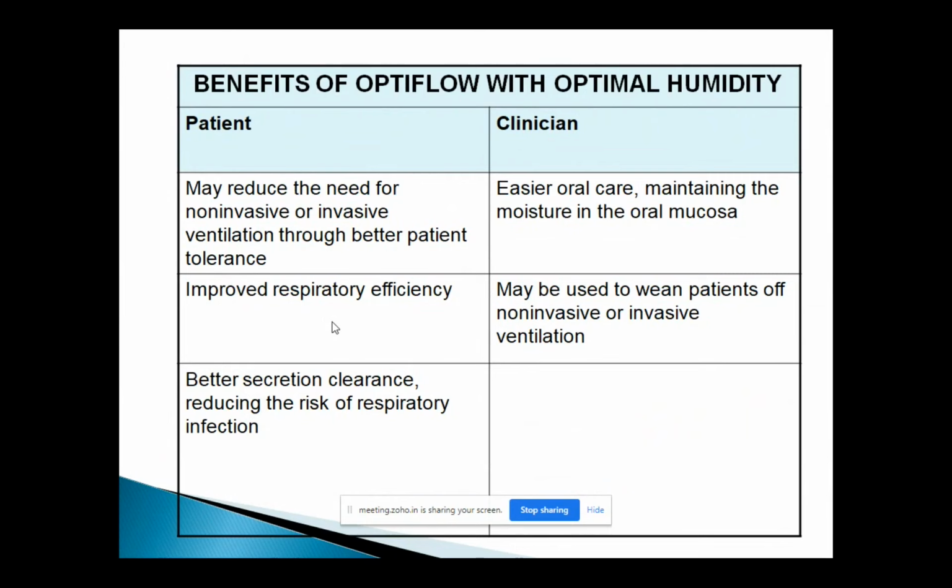So the way we wean the patient from non-invasive ventilation, we keep the OptiFlow ready. We take them off, and try them on OptiFlow for 2 hours. If we feel like they're getting tired, or if their carbon dioxide level goes up, then we will switch them over to non-invasive ventilation. So you can alternate the treatment, and then you can slowly see the amount of time they're spending on OptiFlow is getting longer, and the non-invasive ventilation is getting shorter. And then you completely stop the non-invasive ventilation, and continue them on OptiFlow for a few days.